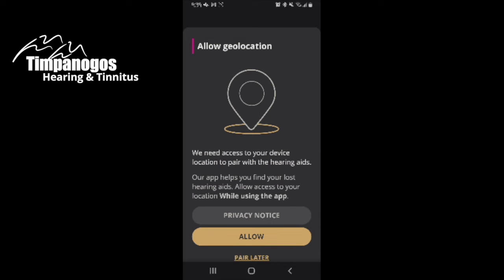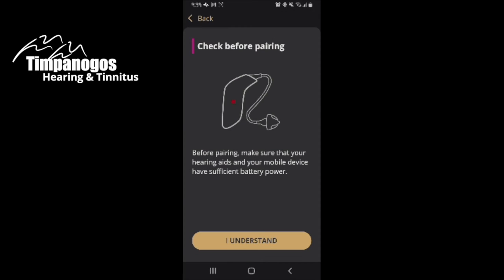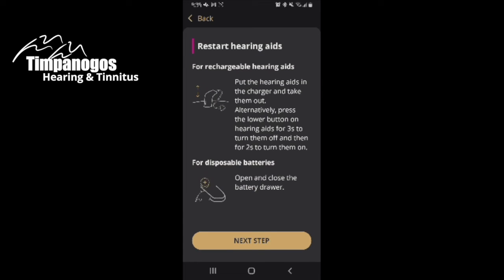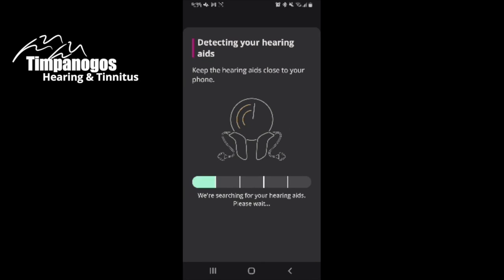I do want to allow the location so I can use Find My Hearing Aids if I ever lose them. And I understand I need to have enough battery power — I just took them off of my charger, so they should be ready to go.